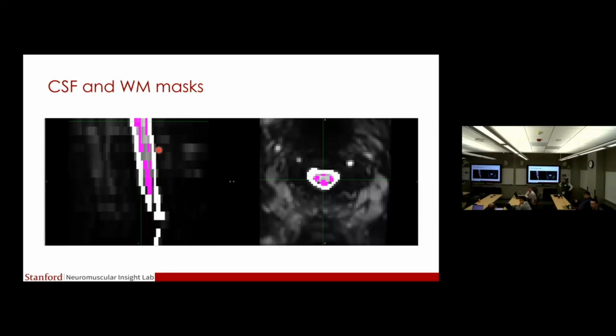Yeah, non-spine mask. They created something like a non-spine mask and took 70% of the variance from that signal as a regressor. I think Molly Bright's group is doing that, and she has some recent publications in Human Brain Mapping showing the benefits of external PCA. But we haven't implemented it in our processing pipeline. Again, so many options and a lot of things to really systematically compare.